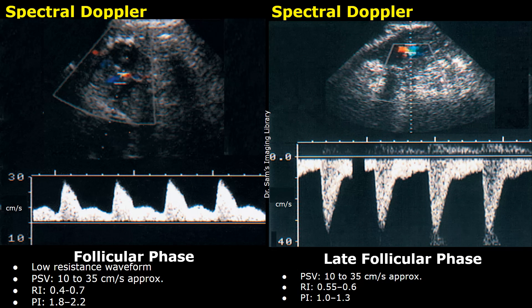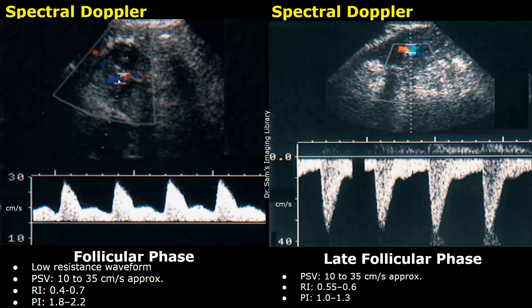Hello everyone, this is Dr. Sam, and today you will learn about ovarian artery Doppler waveforms throughout the menstrual cycle. We will start with the follicular phase. The sample volume is placed on the ovarian artery and spectral Doppler is applied, and this is the waveform produced. It is a low resistance waveform.